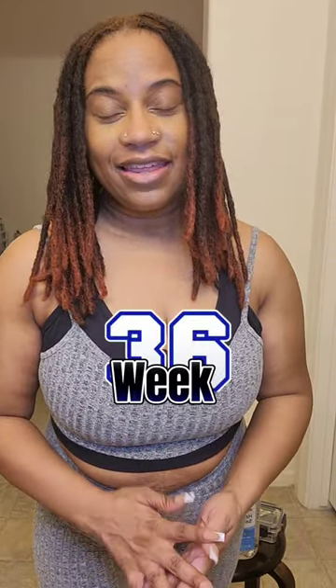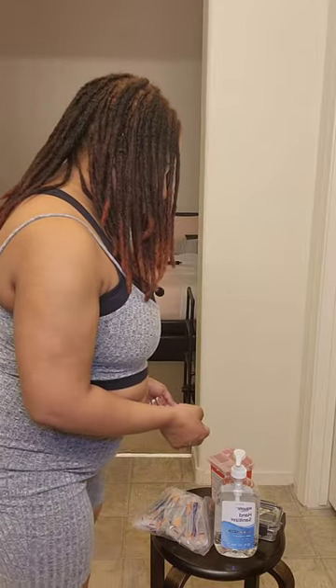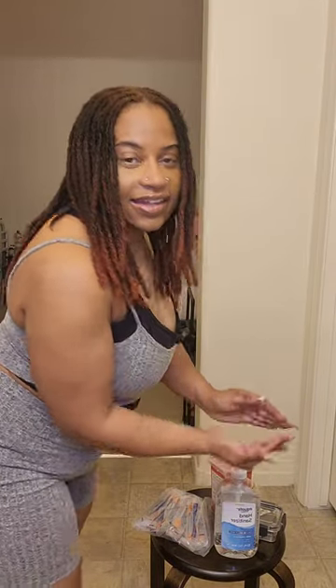Hey y'all, I'm about to do my week 36 tirzepatide injection. I promised after mixing earlier that I was gonna come back and do my injection with y'all, so here we are. I'm doing a tummy injection, so that's why I have this on — this is one of my little workout outfits. I have everything here that I need. First and foremost, let me sanitize — always do that. Make sure you clean your hands. These are my insulin syringes, these are 1ml or 100 units, and I need to inject 75 units today. I'm dosing up to 7.5 milligrams.